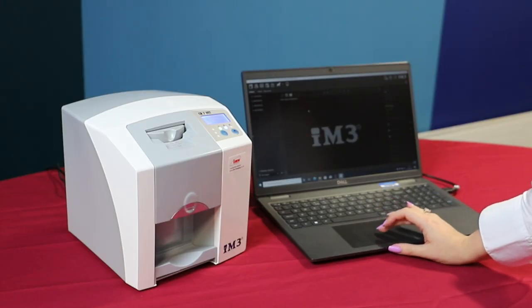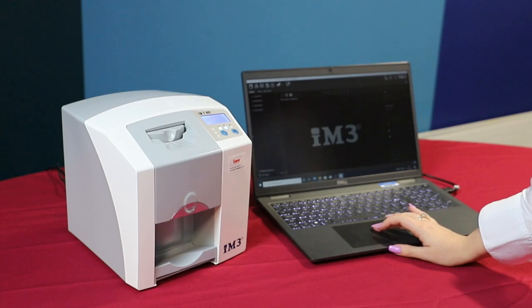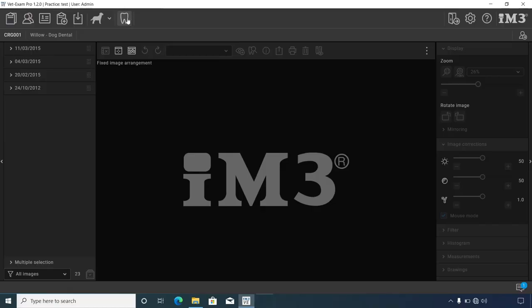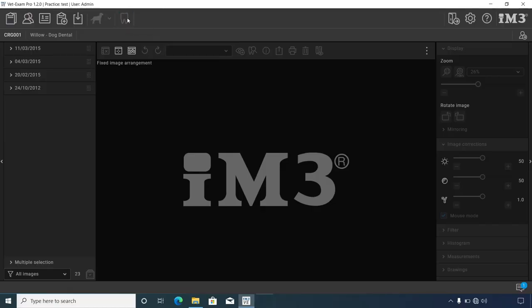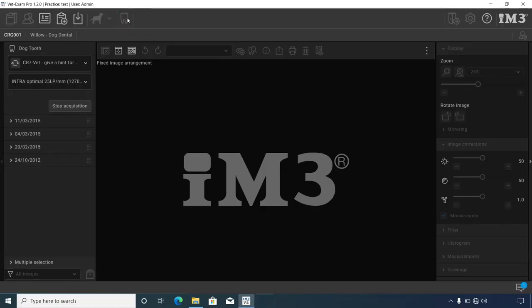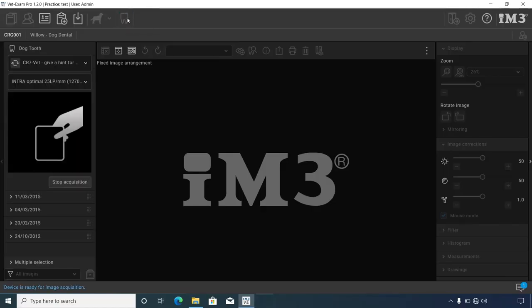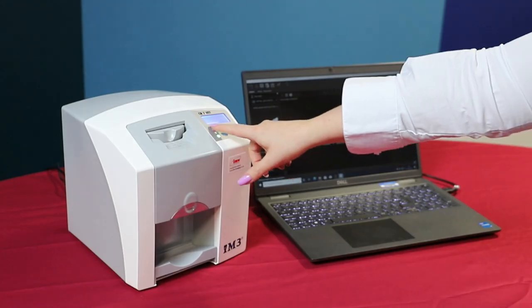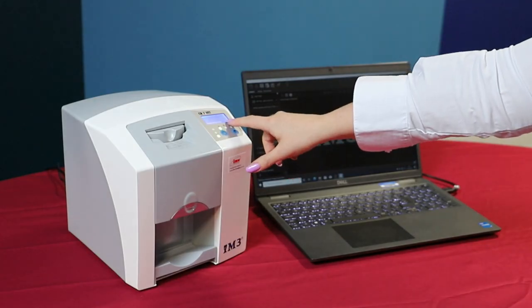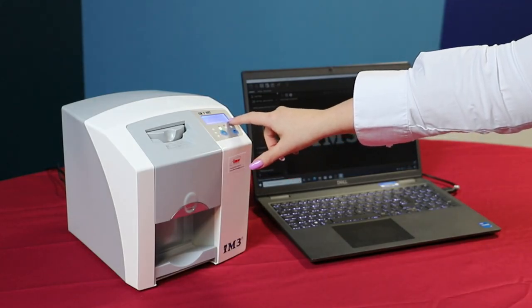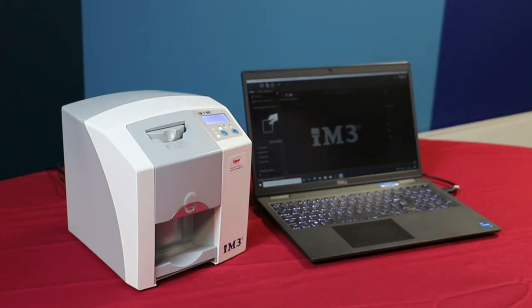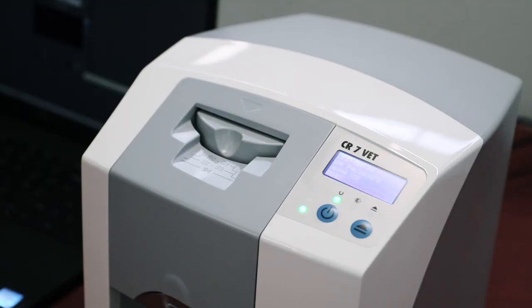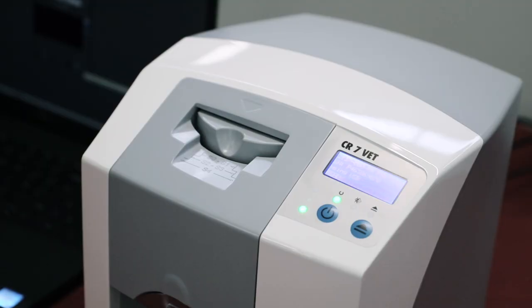To activate your CR7 to receive the plate, click the dog tooth on your Vet Exam Pro software. This will start to load on the CR7 with a drawer opening to receive the plate.